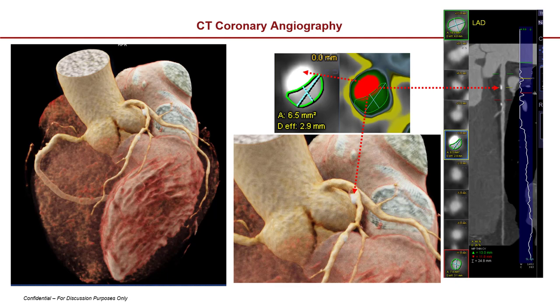Coronary angiography is a very powerful tool because it allows us to identify areas of disease processes. In this picture I have an example of a calcification, and I can measure down to the millimeter how large that calcification is and how narrow the lumen of that vessel is becoming. We want to identify if there's a stenosis in any of these vessels that's 50% or greater — that's the goal of CT and cardiac imaging.